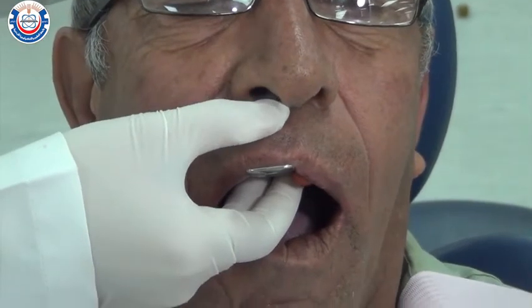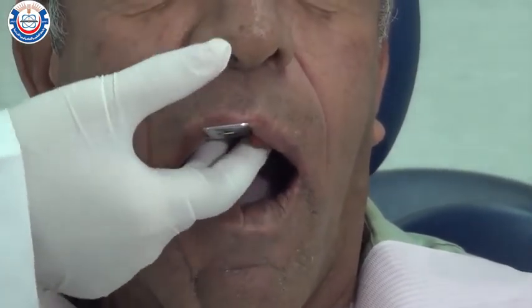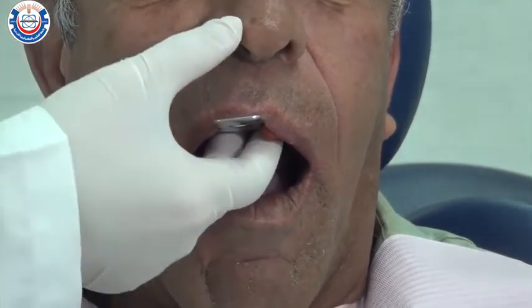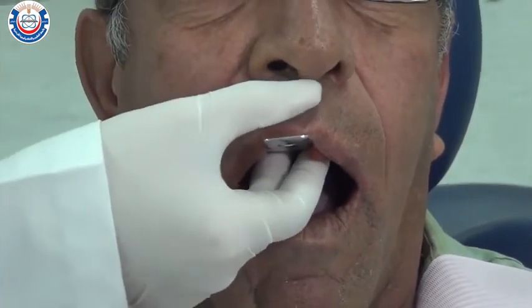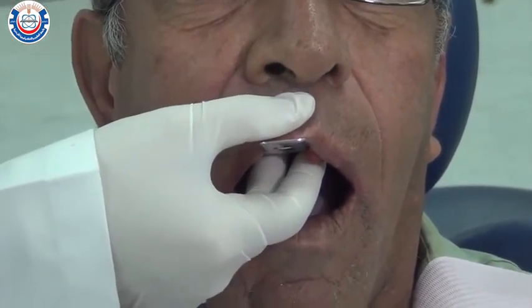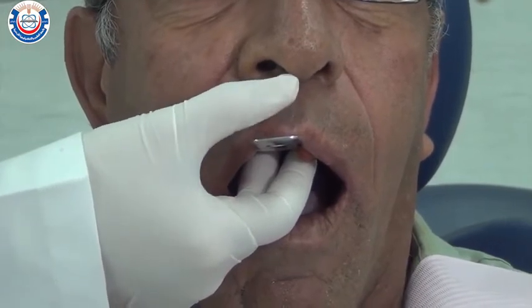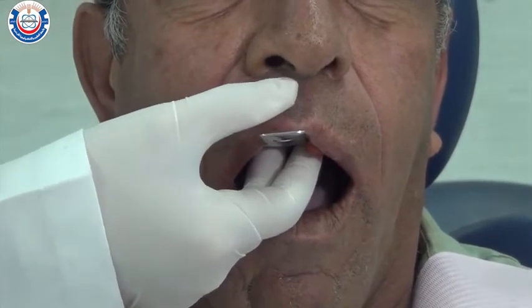Instruct the patient with a relaxing voice to breathe slowly through their nose. If the patient has a tendency to gag, the patient's head should be tilted forward so that excess saliva can run out of the mouth instead of down the throat. You may use a saliva ejector to remove all excess saliva.